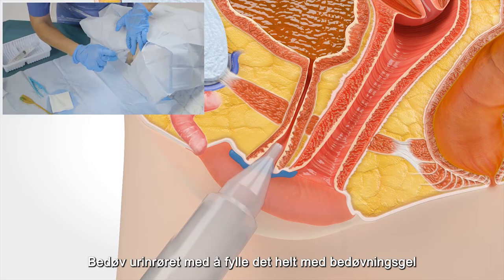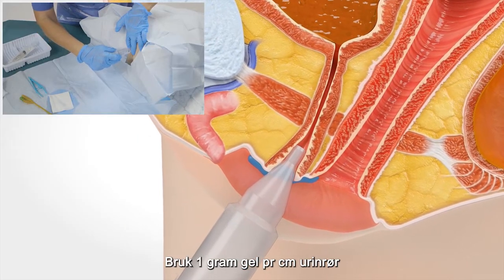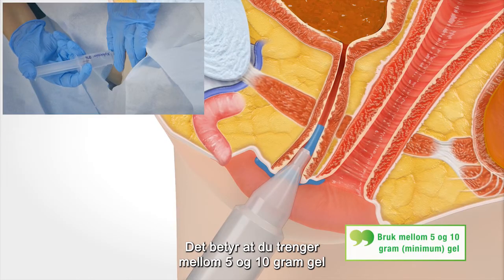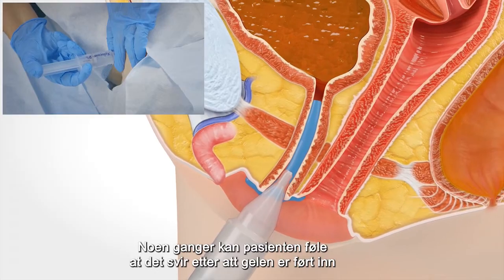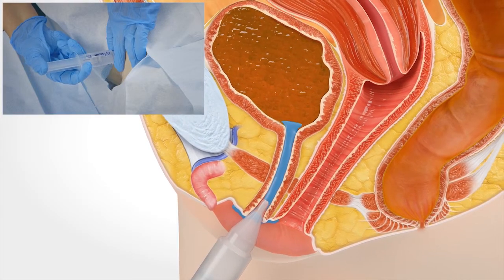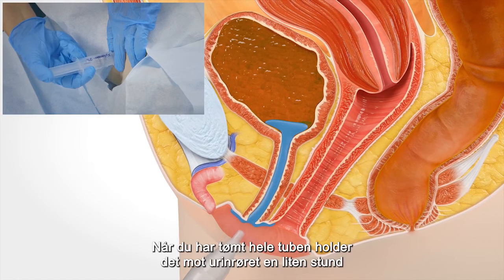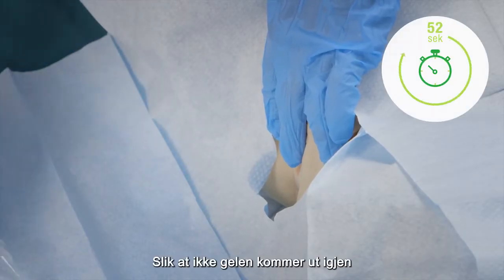Anesthetize the urethra by completely filling it with anesthetic catheter gel. Use 1 gram of gel per centimeter of urethra, meaning that for a woman you need approximately 5 to 10 grams of gel. Sometimes the patient might feel a slight stinging just after the gel is used. When you have emptied the entire tube, hold against the urethra for a little while so that the gel doesn't come back out.